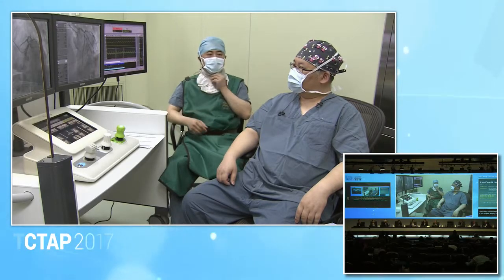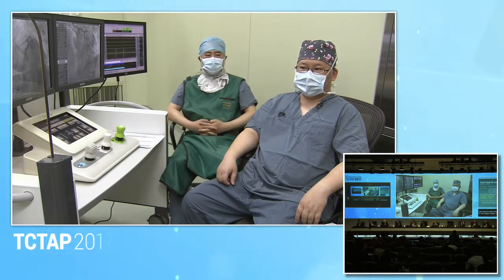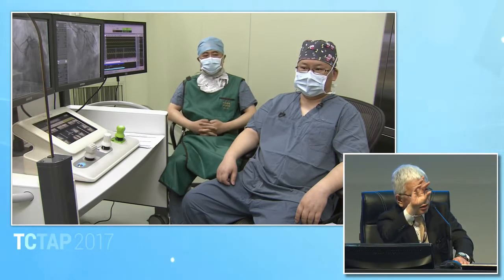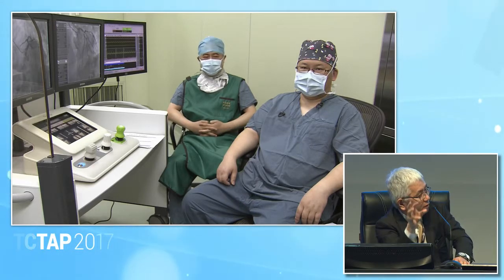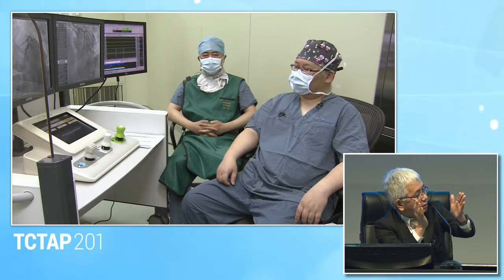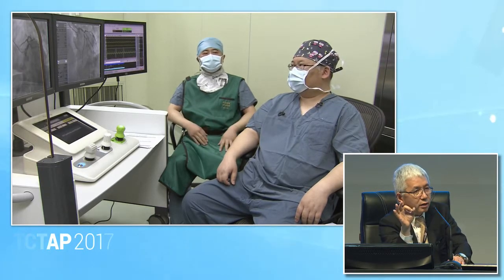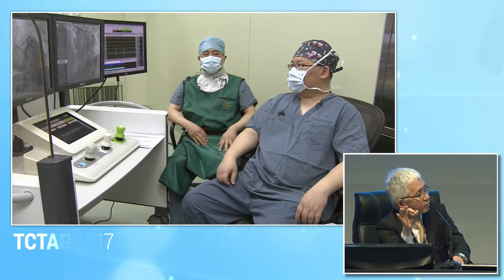Okay. In this case, I think about two options. One option is to stent the left distal circumflex first, with kissing balloon, and then insert the second stent in the LAD. That's one option, and use the DK crush. DK crush is one Dr. Chen showed every time with good results.